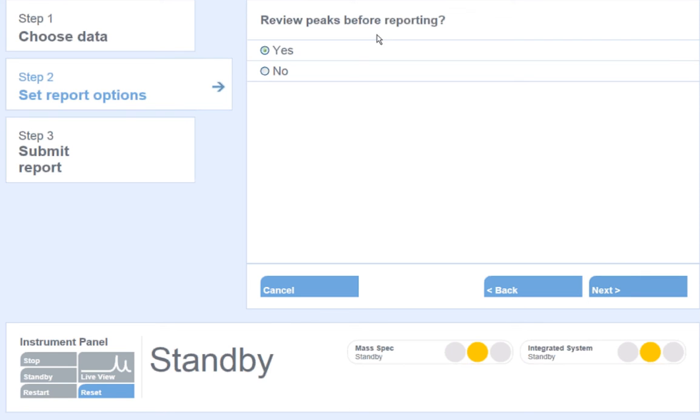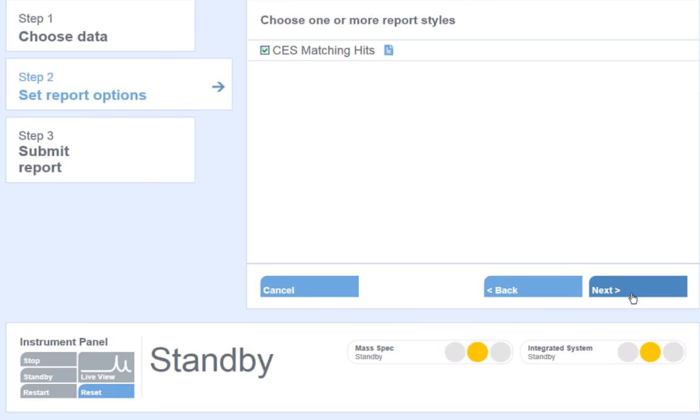Review peaks before reporting. If I choose Yes, Analyst will open data files to allow me to look at the chromatograms for each analyte and adjust the integration parameters as necessary. Selecting No will output and process the data without any review on my part. I will select No and hit Next.